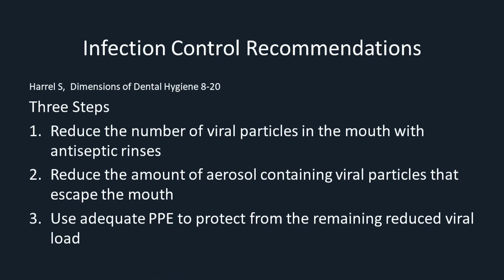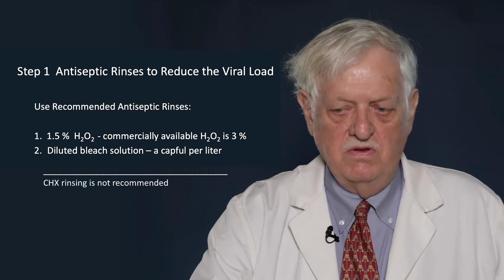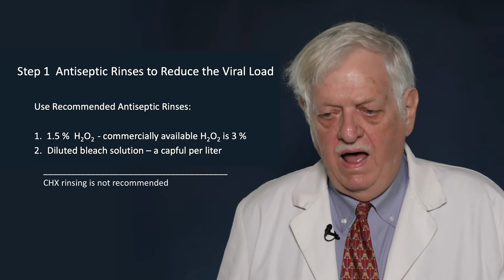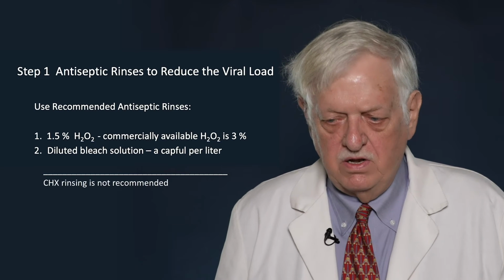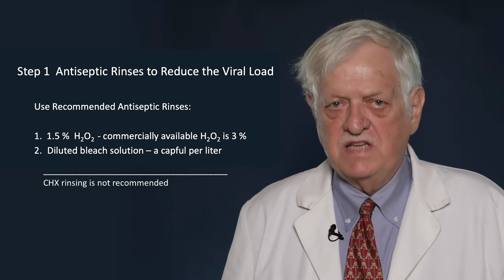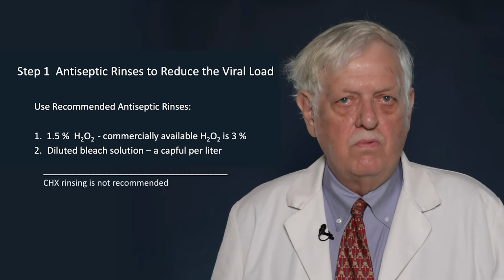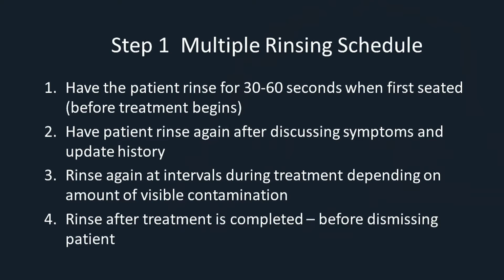Number 1, antiseptic rinses. What antiseptic rinse do you need to use? Well, it seems to change every week. But at this point, I would recommend using diluted hydrogen peroxide rinses. I have tried the diluted bleach solution and the diluted povidone iodine solution. My patients hated the taste. The hydrogen peroxide seems to be the most current. I would recommend it, but you need to watch that closely because it does seem to be changing frequently.